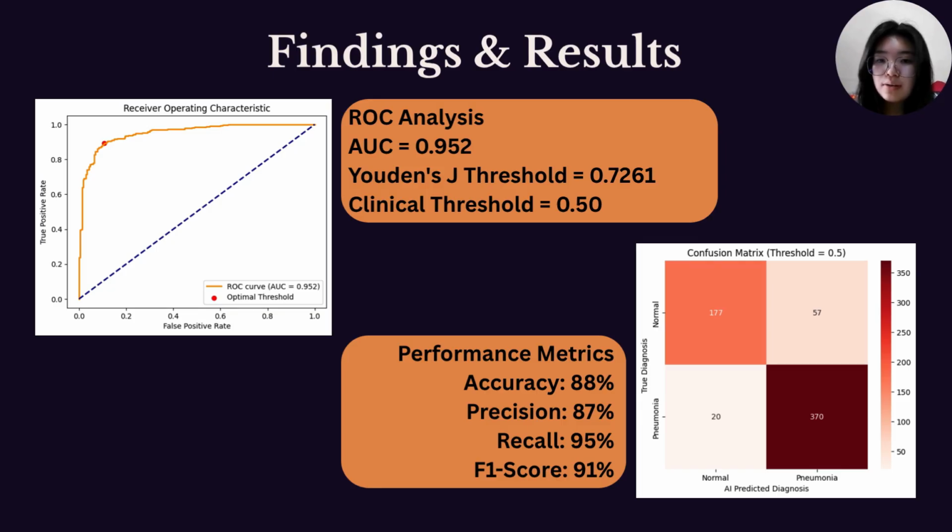Overall, the model achieved 88% accuracy, 87% precision, and a 91% F1 score. Although the precision is slightly lower, the high recall is desirable in medical screening because it minimizes missed pneumonia cases.